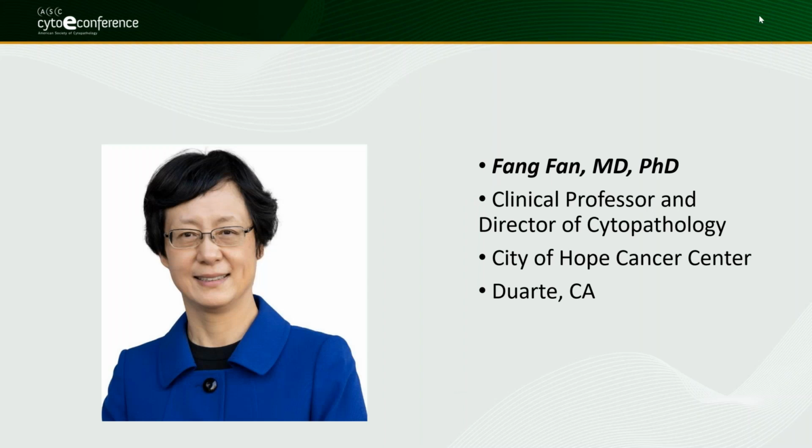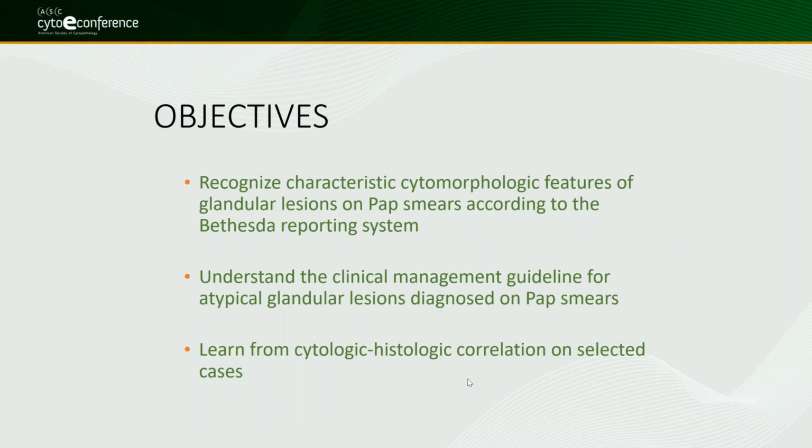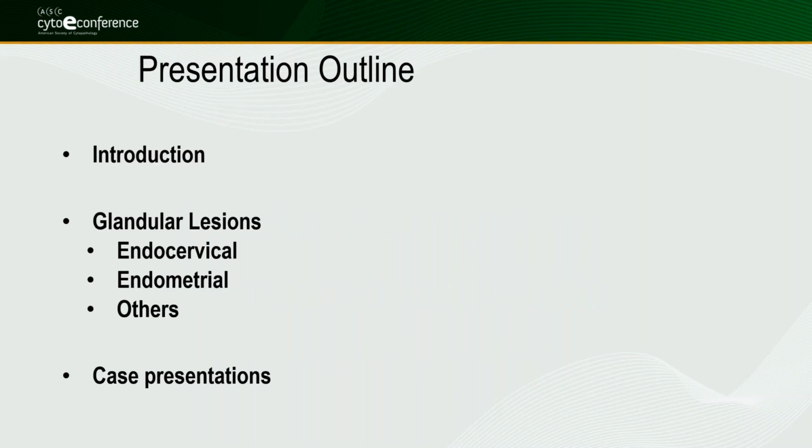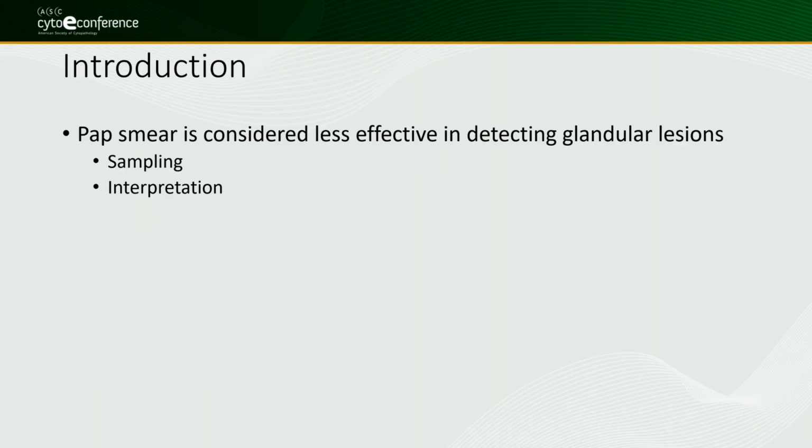We'll do a quick review of characteristic morphologic features of glandular lesions on pap smears, and briefly discuss the management guideline, and then we'll do a few case presentations to see how we can learn from cytohistocorrelations. This is just a brief outline of my presentation today.